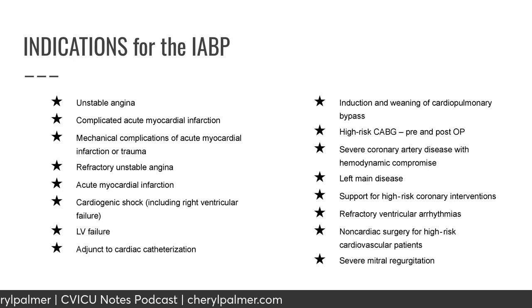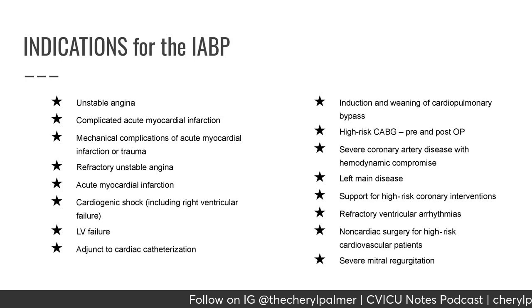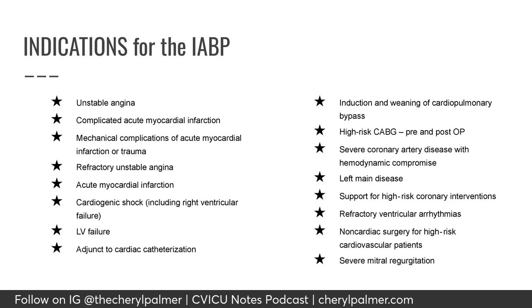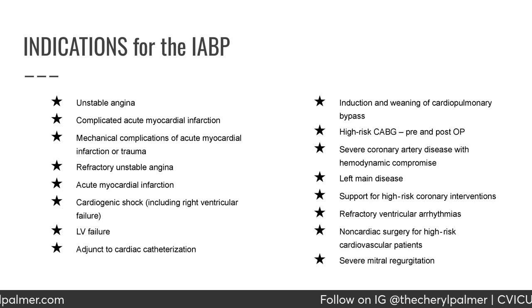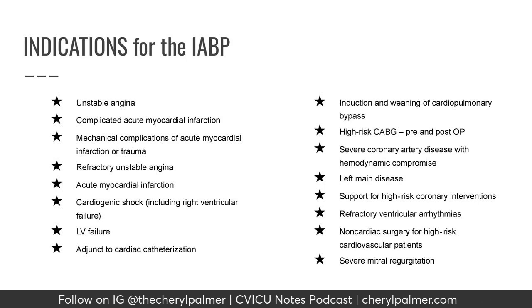So a lot of times when people are coming back from the OR, for example, you may hear that they couldn't quite come totally off the bypass and remain hemodynamically stable. So they added the intra-aortic balloon pump. High-risk CABGs also, pre and post-op, have this in place or can have it in place.